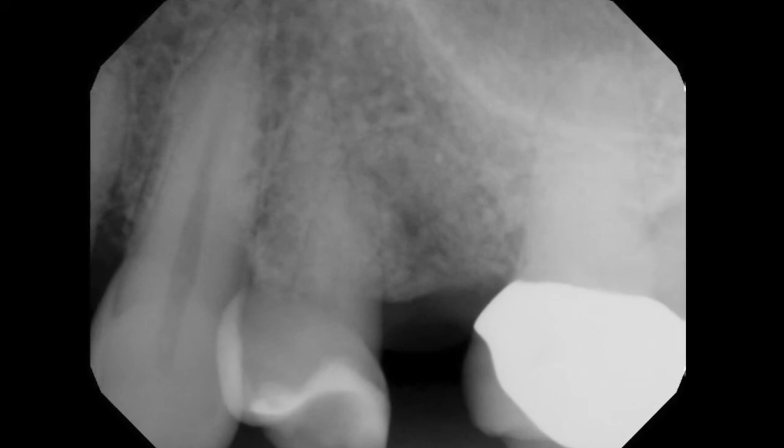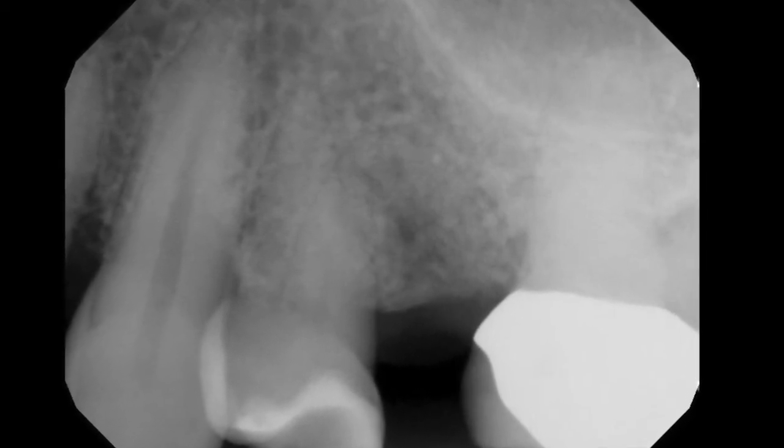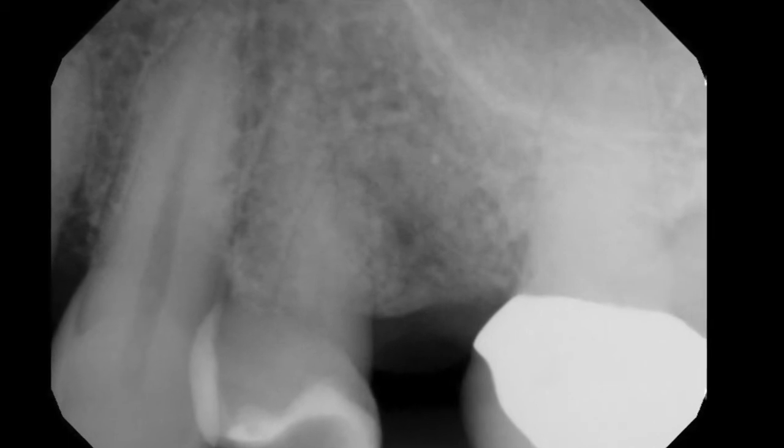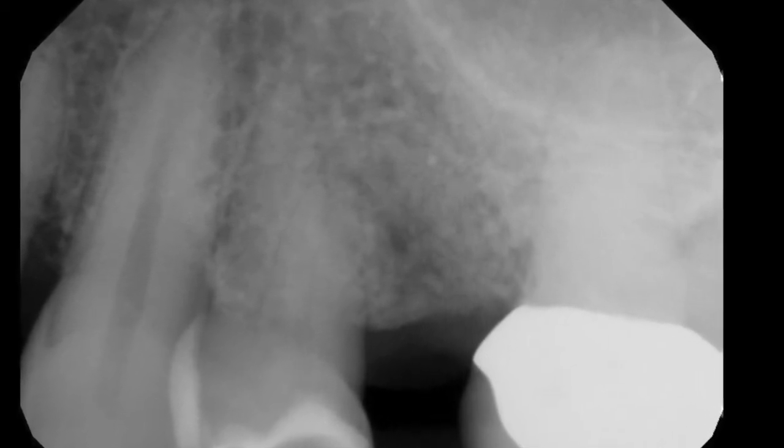The osteoclasts eat away this material. It's calcium and phosphorus in a bovine Achilles tendon matrix, and you can see that the osteoclasts are actually eating away the synthetic material, and osteoblasts are laying new bone. We now have a site that is acceptable for a dental implant four months after surgery.